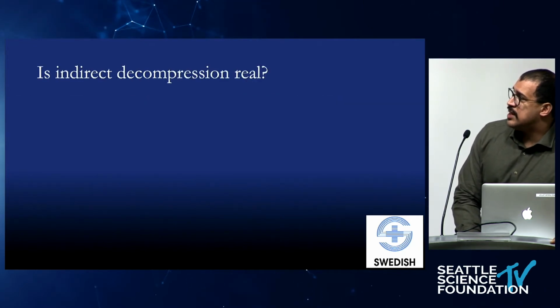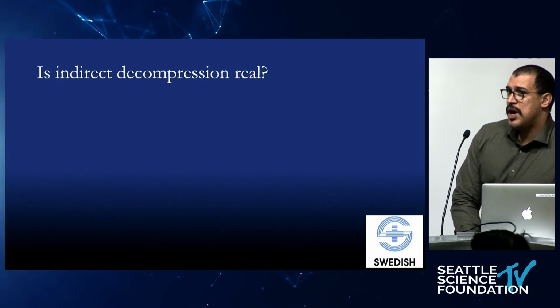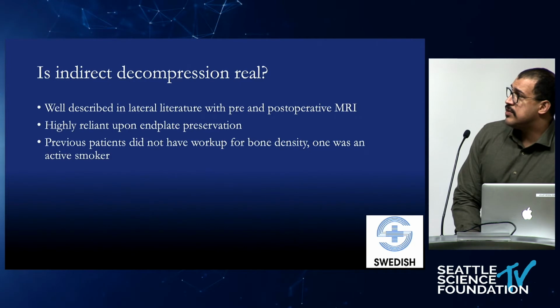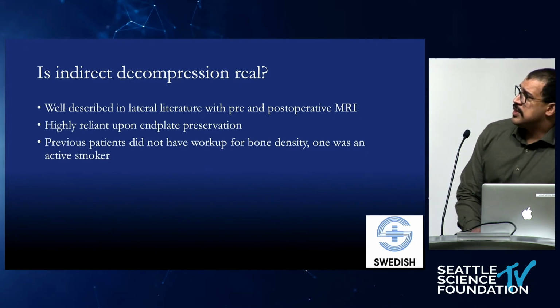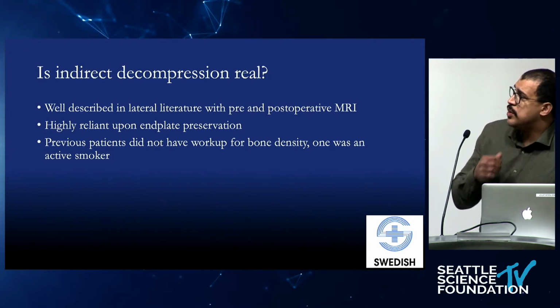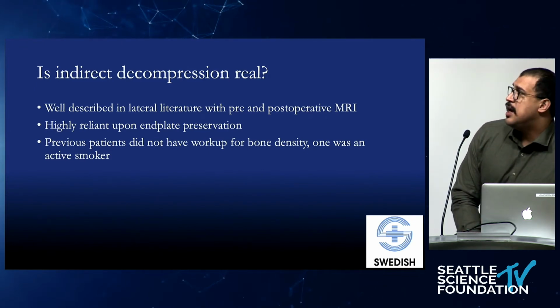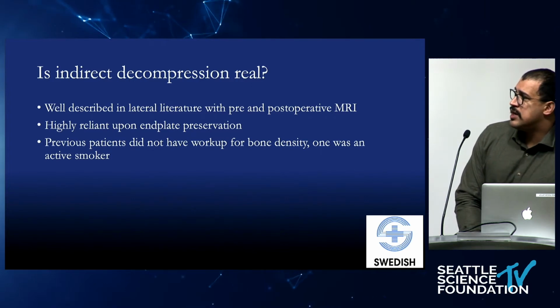And looking at that, I think we all believe in indirect decompression. That's why we use these MIS techniques. I think there's very good literature out there. I know there's a study out of Japan recently that showed consistent, greater than 200% increase in the canal volume following lateral surgery with pre and post-operative MRIs, and sustained all the way out to 2 years.